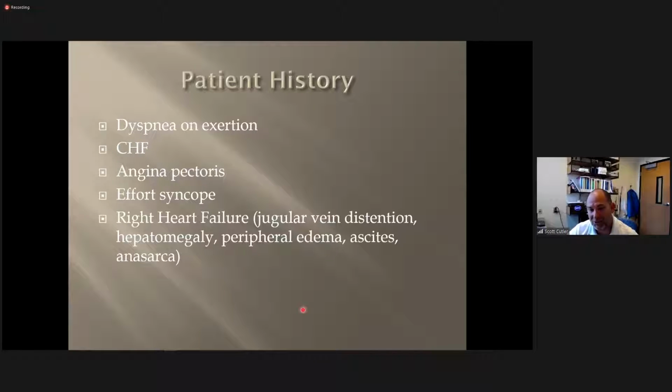Huh. How's your valve doing? That's one possibility. All right, so the real question now is, did we see Michael's valve well enough as we've scanned each time? Have we noticed 3 leaflets? Have we noticed that they're opening correctly?